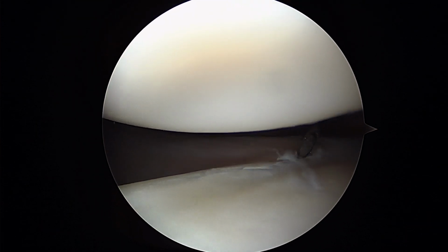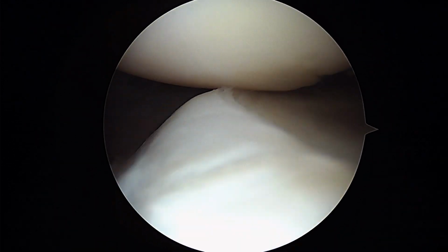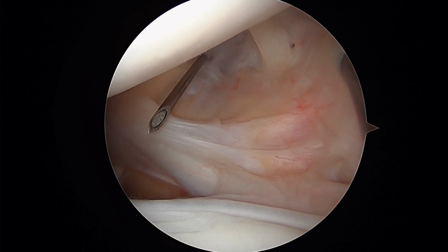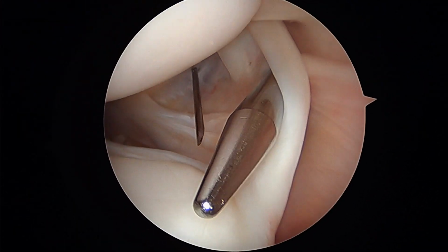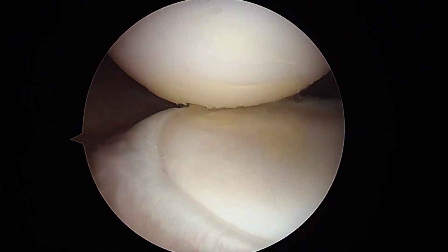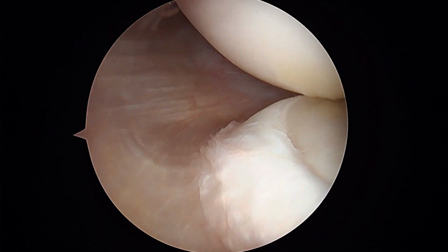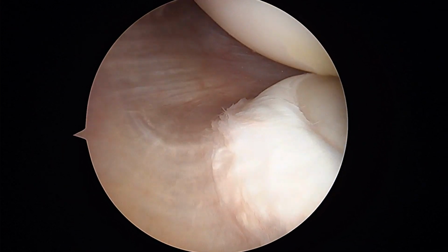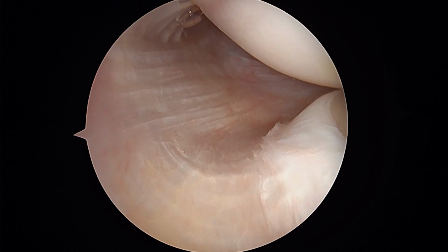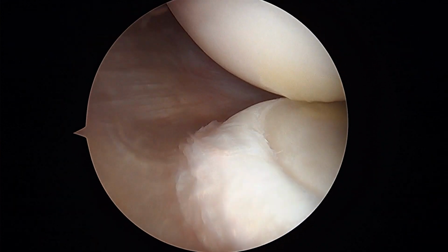And then this is the anterior inferior glenoid. And we can see all the way around to the back here. So we're going to put our second cannula right there. As I pull back a little bit, we'll give you an overall picture of how this glenoid looks like an island. See how much room there is? There's just a lot of capsular laxity, and that's going to all change at the end of the surgery. But there's really not a well-defined posterior band of the inferior glenohumeral ligament, which normally runs right in this region.